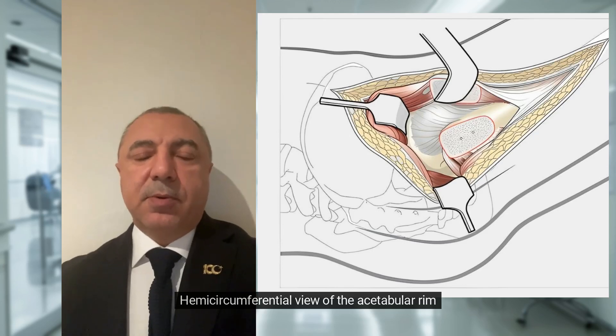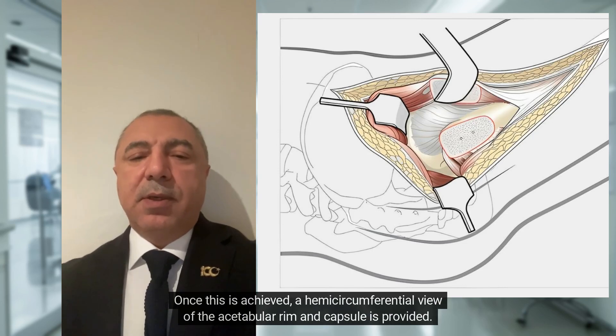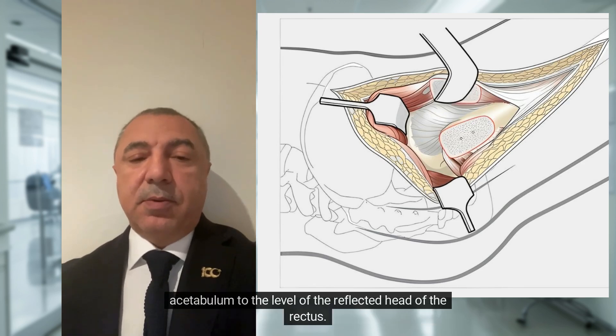Hemicircumferential view of the acetabular rim: mobilize the proximal portion of the vastus intermedius to expose the anterior capsule. Once this is achieved, a hemicircumferential view of the acetabular rim and capsule is provided. This starts posterior and inferior to the retracted piriformis tendon and extends anteriorly around the acetabulum to the level of the reflected head of the rectus.